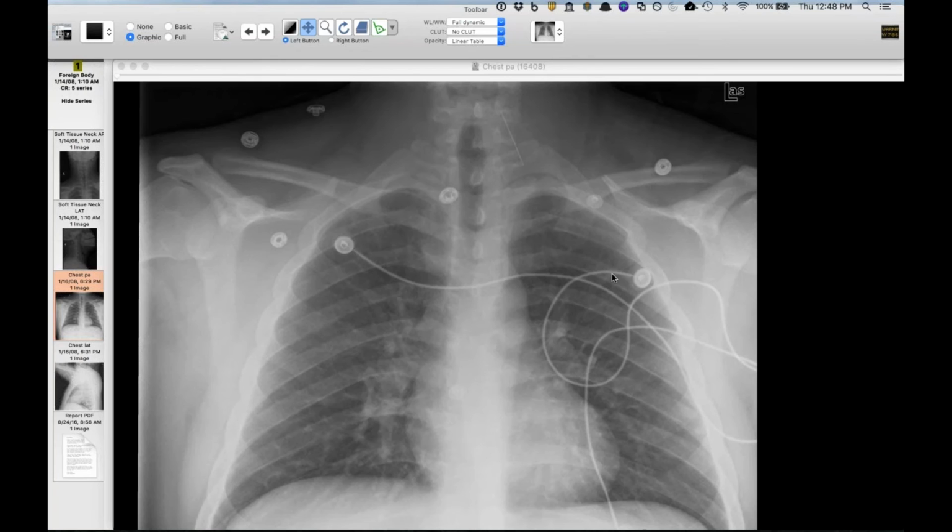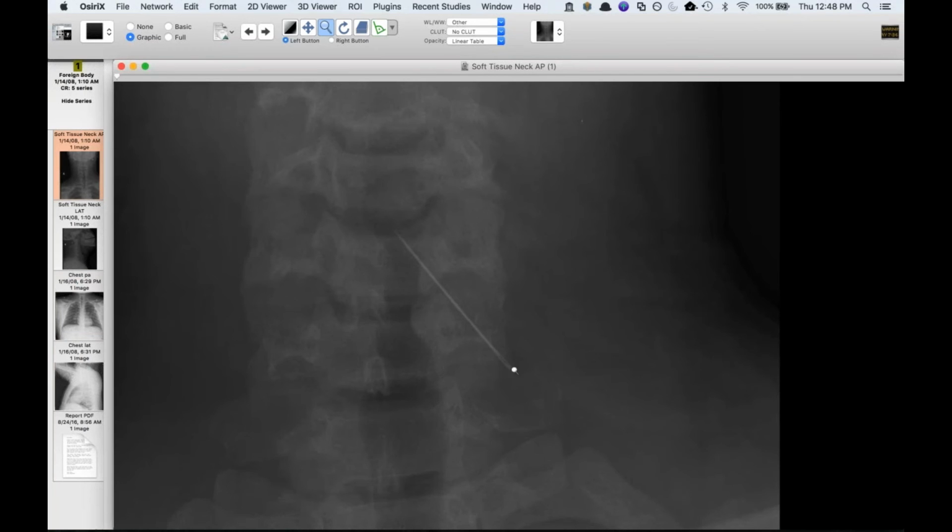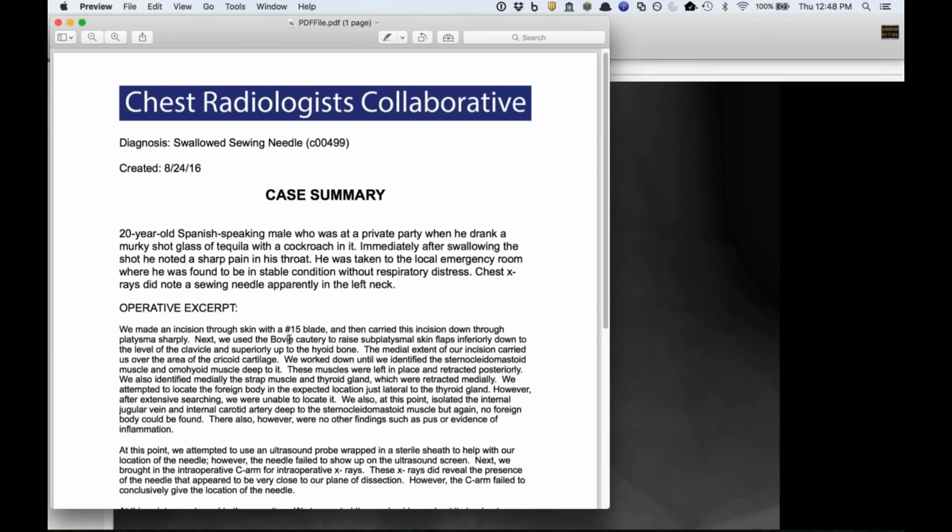Do you guys see a radiograph? We do. All right. This is a quick one. I think this is entertaining, and Seth and Brand especially will like this because this is the kind of patient population they would see, especially at Grady. This is not outside the patient, and it looks like a needle. They did a neck radiograph too, and you can actually see on the neck radiograph the eye of it, and it's a sewing needle.